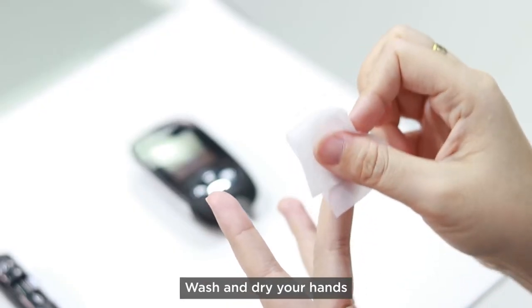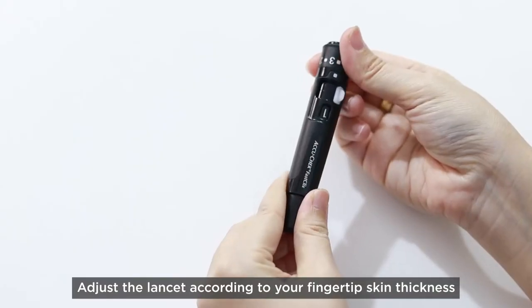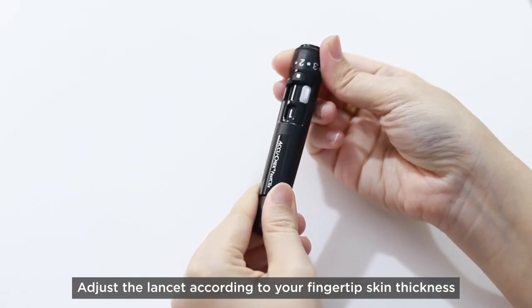Wash and dry your hands. Adjust the lancet according to your fingertip skin thickness.